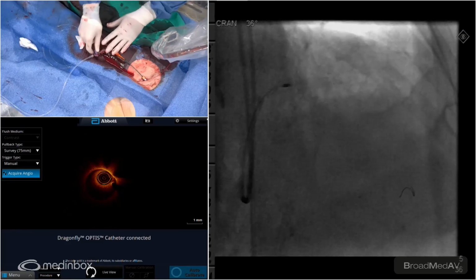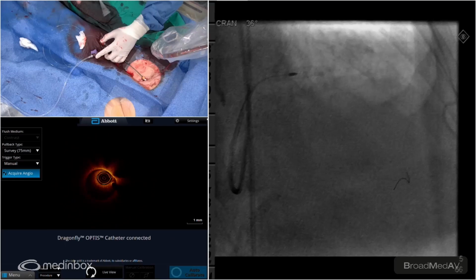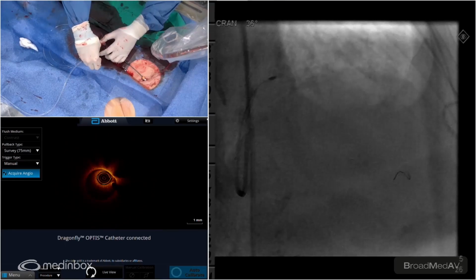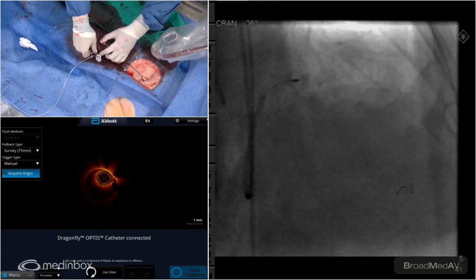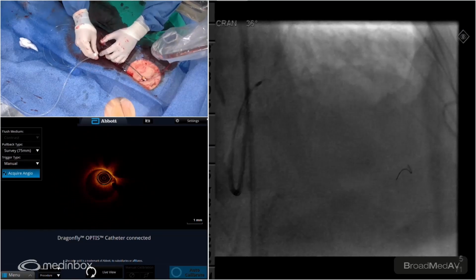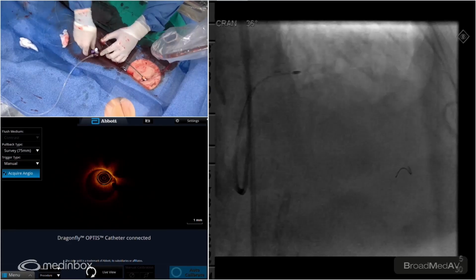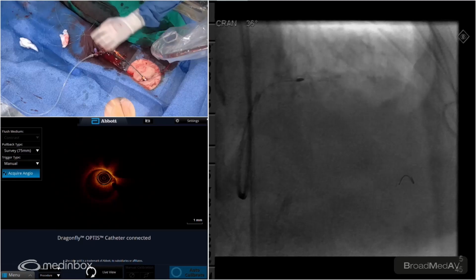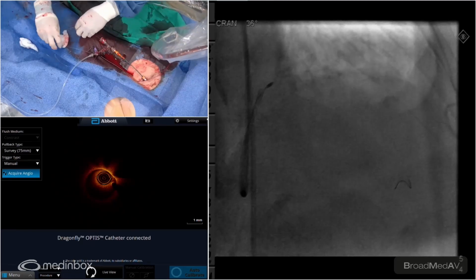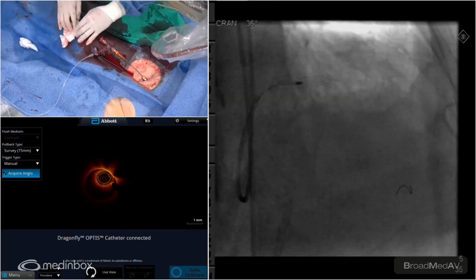Our initial plan was, if there was still very thick calcium, to go with the larger burr. We still reserve that option. Yes. Hopefully the OCT will be a tie break. It's unfortunate we couldn't have a pre-OCT. It'd be nice to see what cracks we got. Let's do that. That's our original universal. Yes. The lucky BMW.